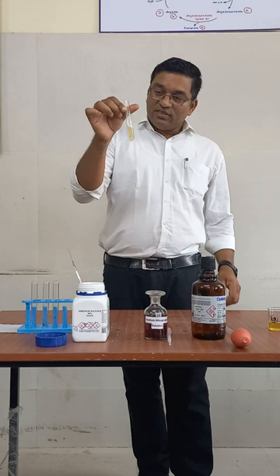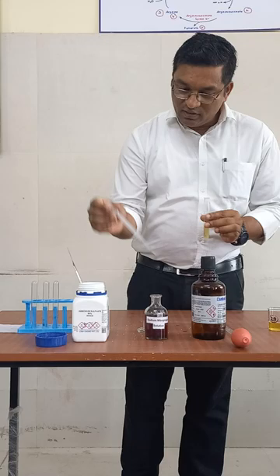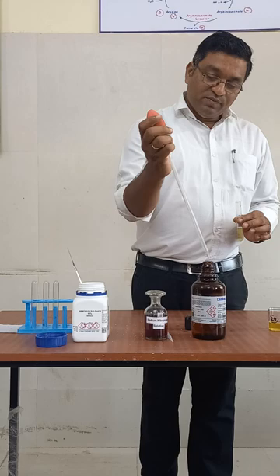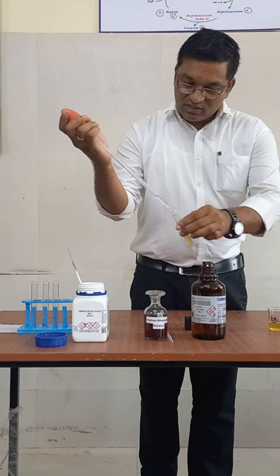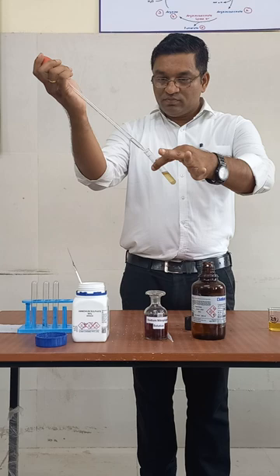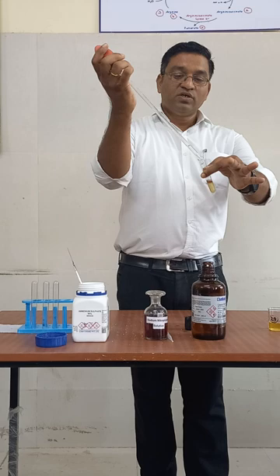Now add one drop of freshly prepared sodium nitroprusside. After this, add 3 ml of liquor ammonia slowly by the side of the test tube. Observe the change — you will notice a purple color ring at the junction of the two solutions, that is liquor ammonia and urine solution.